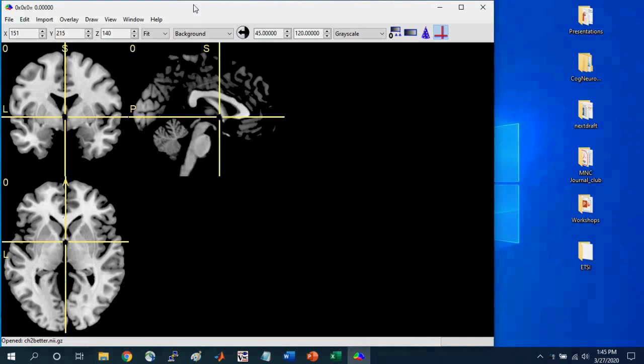So when you open it, you should notice a brain file will be loaded up. It might be different than what you see here. So whatever file I have here is based on the previous time I had MRI-Cron open, it loaded up whatever file was open when I closed it.